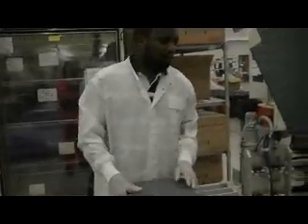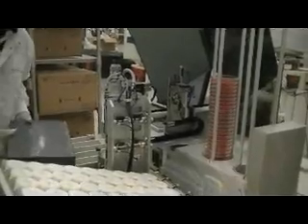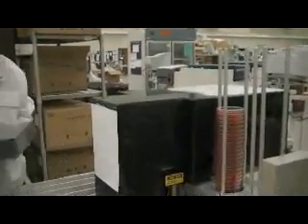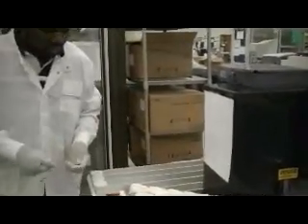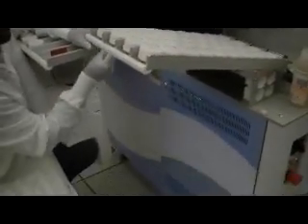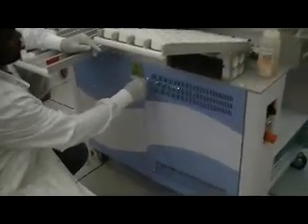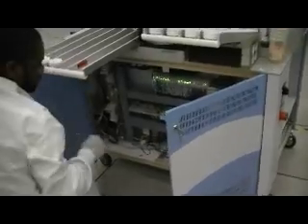Now you've got everything on there. It's all set and it's fine. It's in good working condition. You can close your machine, and you can just double check and see if everything is also working fine in here.